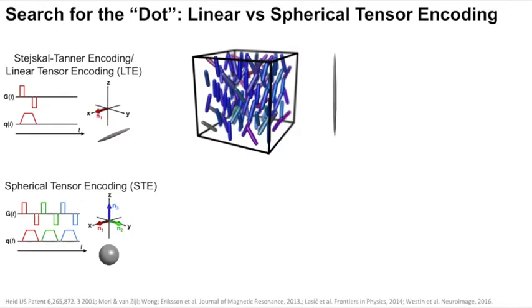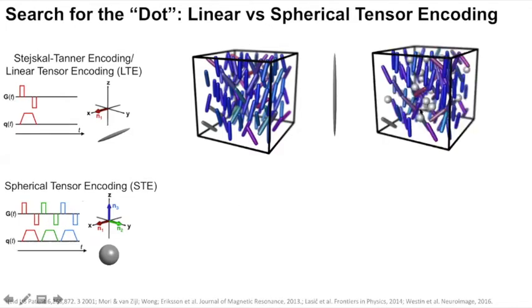If you measure in the direction from top to bottom with conventional diffusion encoding, it will be very hard to disentangle from a scenario in which there are some dot compartments, because you have a little bit of restriction from each of these sticks that are not perfectly aligned with the gradient direction. So it can seem like there is a very slowly decaying signal at high B values.